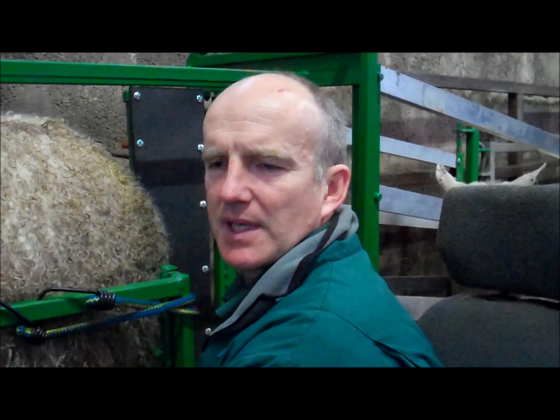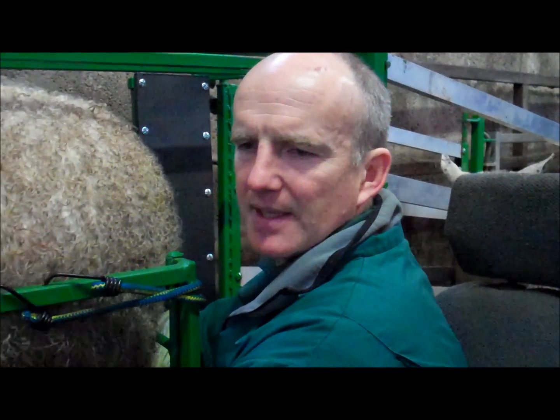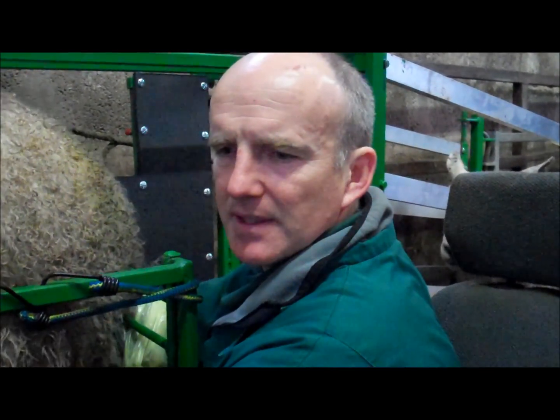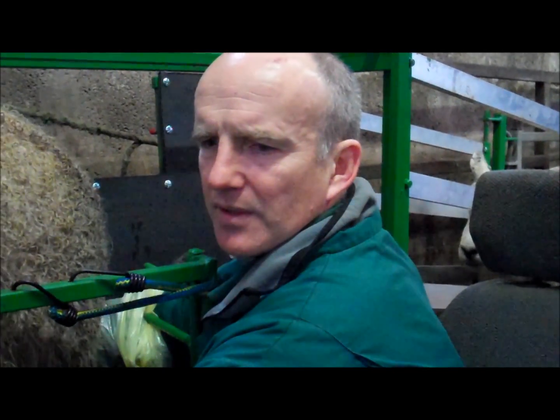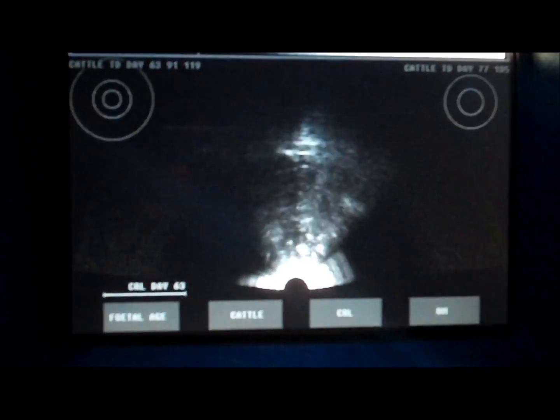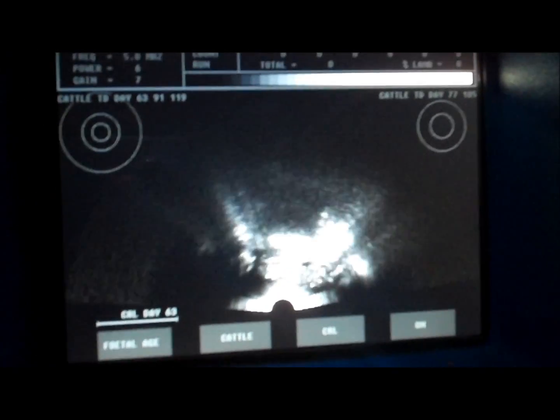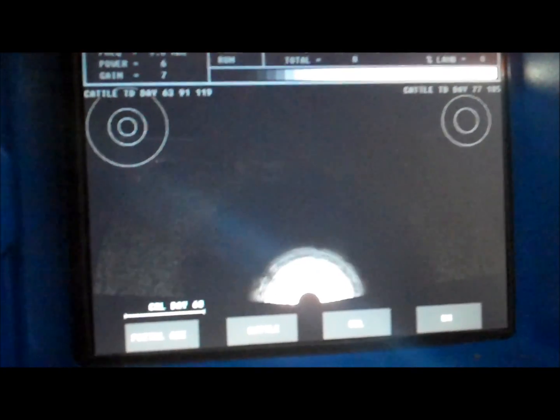The important thing for scanning sheep is to make sure you see all the uterine content. You continue the scan until you lose all the pregnancy, but still have a good contact. Then you come back — right the way back to the back of the pregnancy. One body, two bodies, right through, and out. Set of twins.